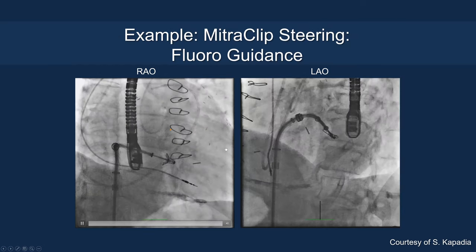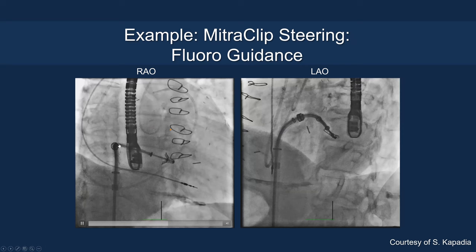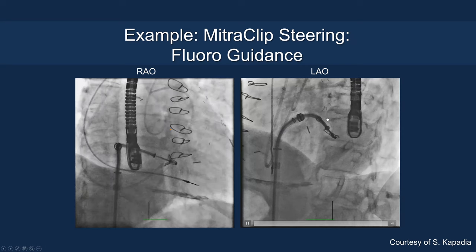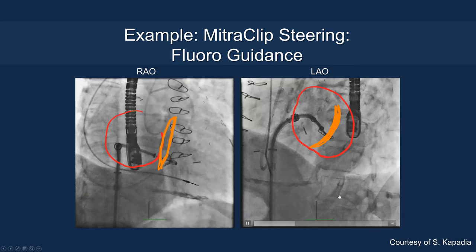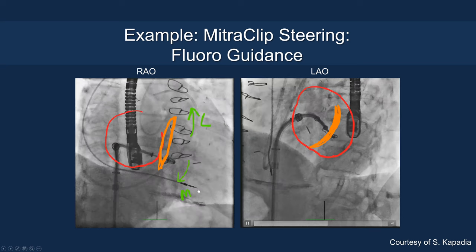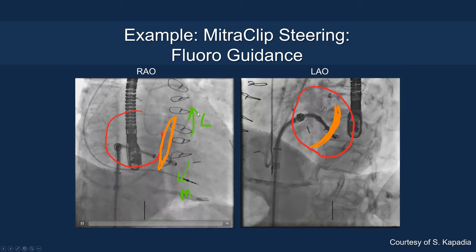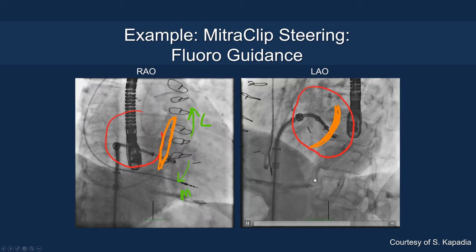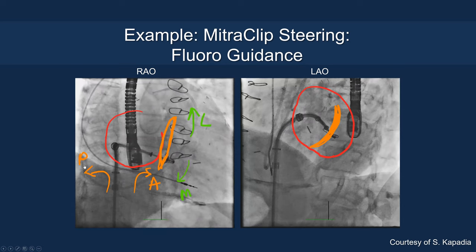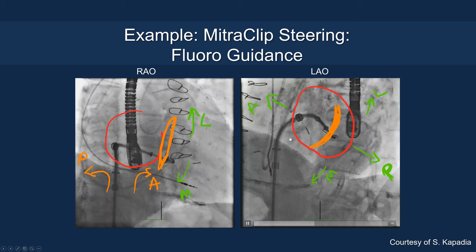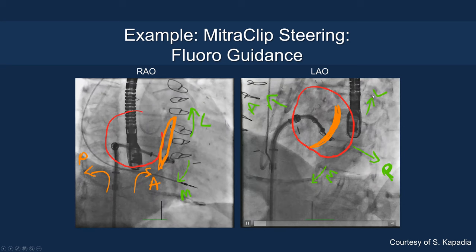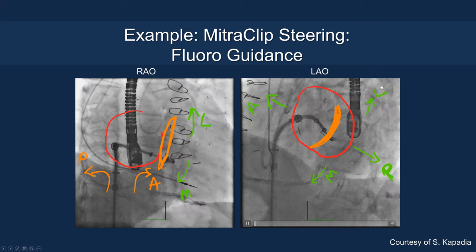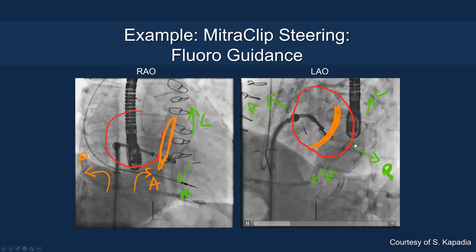Here is an example with MitraClip on the RAO view — a typical projection. On the LAO view, you can see the overlay showing more lateral versus more medial deflection, and anterior versus posterior orientation. Lateral corresponds to the upper left, and medial to the upper right of the screen on the LAO view.